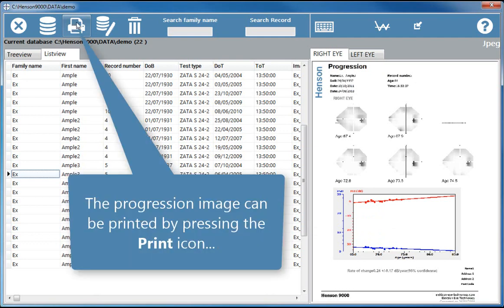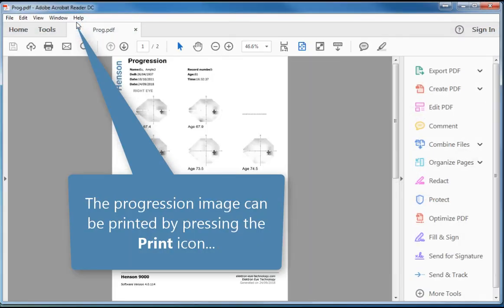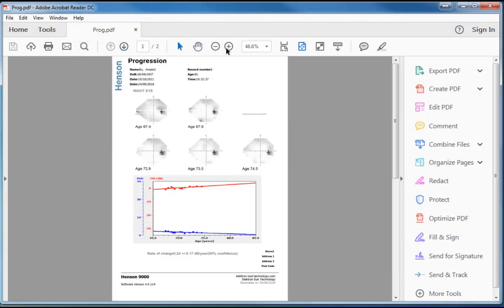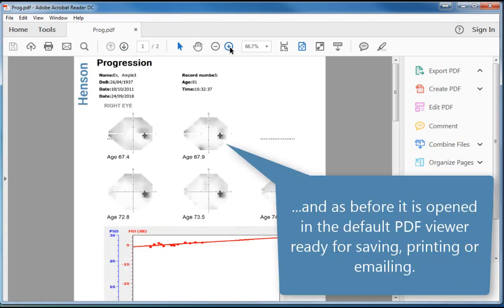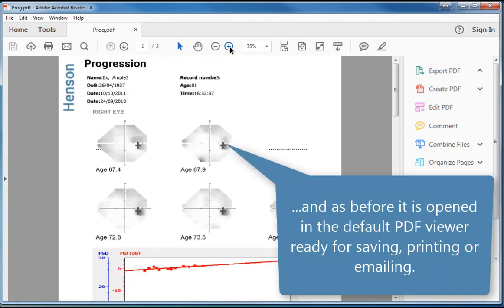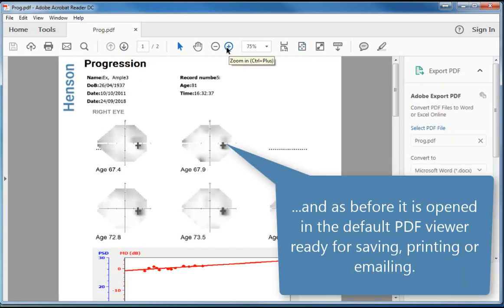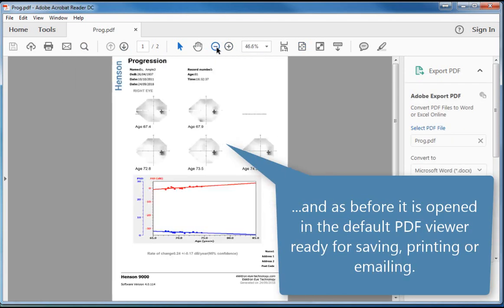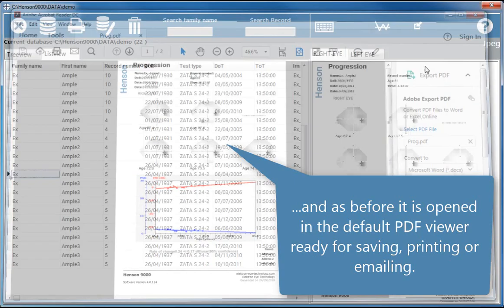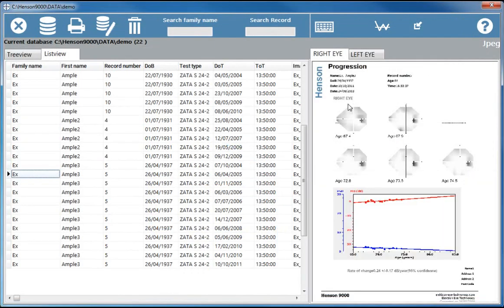The progression image can be printed by pressing the print icon. And, as before, it is opened in the default PDF viewer, ready for saving, printing, or emailing.